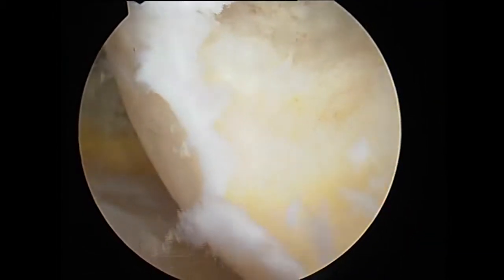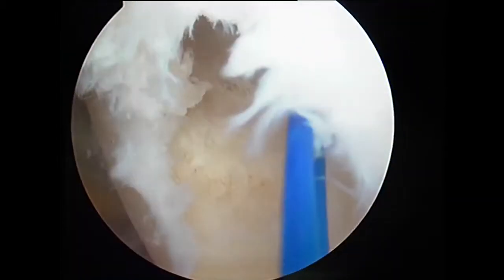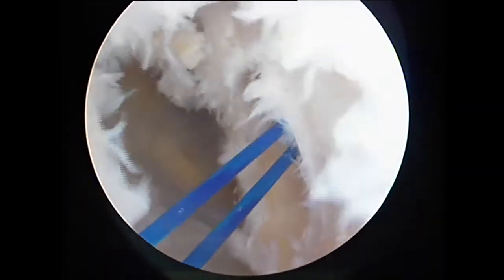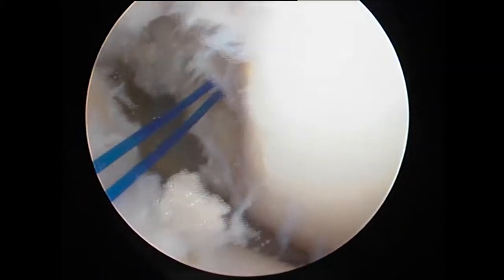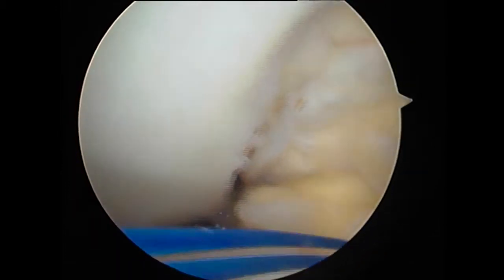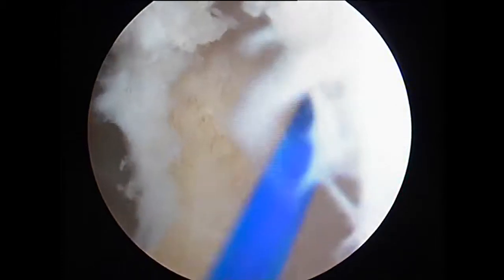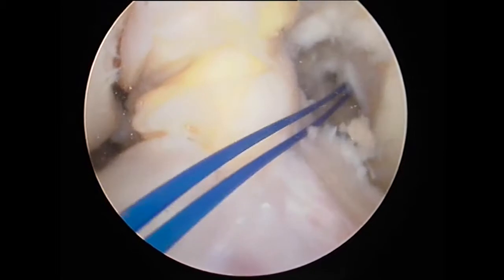Once the femoral socket has been prepared, a suture is passed through that femoral socket and kept inside until the tibial side has been prepared. Now we are looking at where we have created the socket for the femoral insertion of the graft. As the reaming happens through the femoral portal, we are making sure that the medial femoral condyle articular cartilage hasn't been scuffed or touched while performing the reaming of the femoral socket.